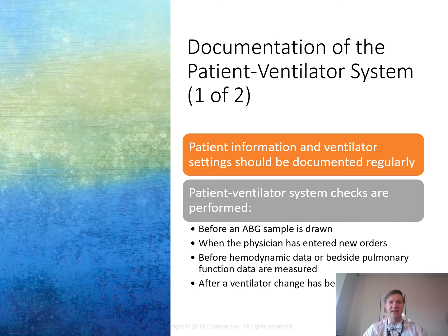So when we're looking at these, before an ABG is drawn, we should go ahead and do a ventilator assessment and record the settings. So that tells us why before, Derek? Why would we do it before? Well, that tells us at the time of the blood gas what was going on with the patient. Not, okay, 4 hours previous to that, there were some ventilator settings. I don't know what the patient was doing right before you drew the gas. I want to know what they were doing right before you drew the gas, because is it possible they can be breathing faster than they were initially? Absolutely. So I want to do a vent assessment. I want to record my values, my compliance, my resistance, my pressures, my tidal volumes, my exhaled tidal volumes.